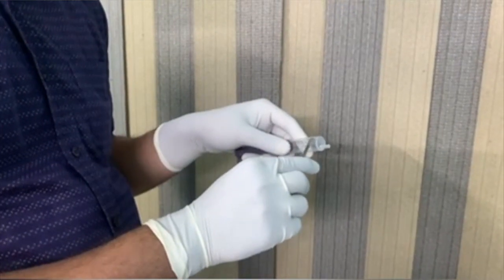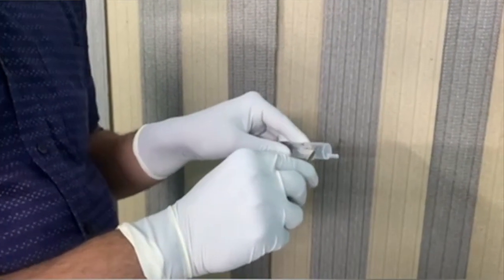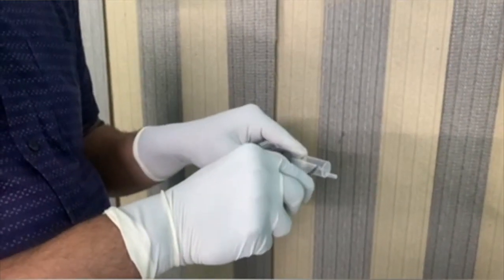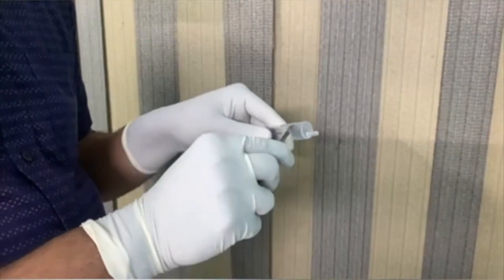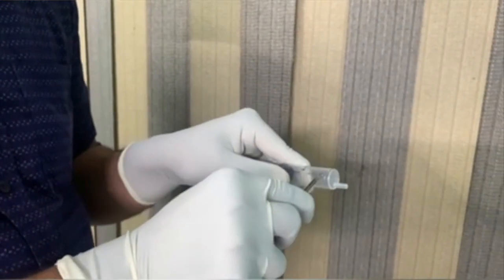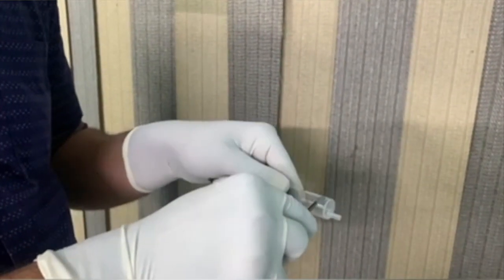Take a 10 ml syringe, use a number 12 blade attached in a BP handle and cut the distal end of this 10 ml syringe. It should be done at the most distal end and it should be done with care.